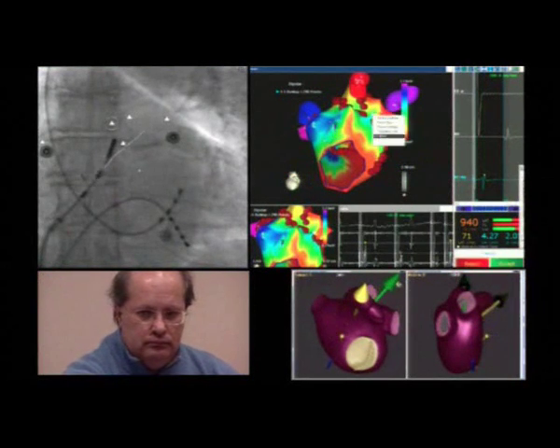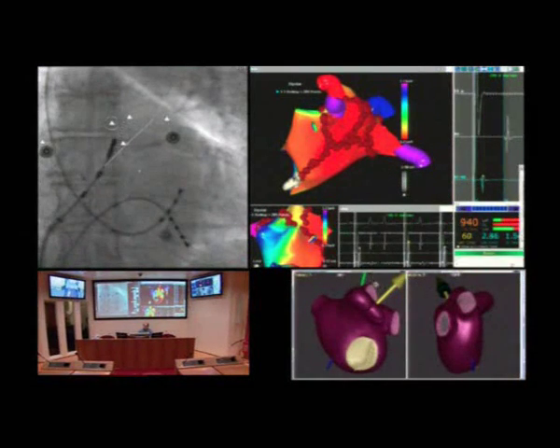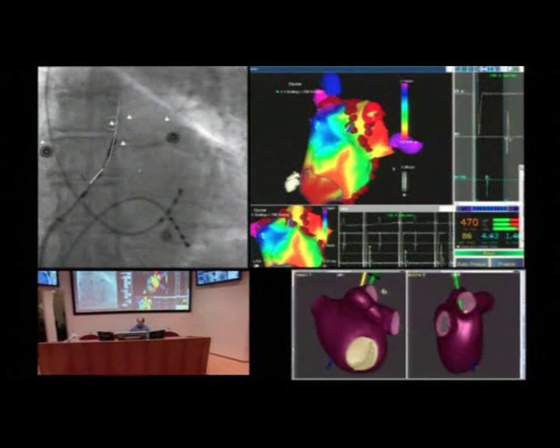The purpose of this phase is to make sure that the pulmonary veins are completely electrically isolated and that the lines of ablation are continuous and complete.